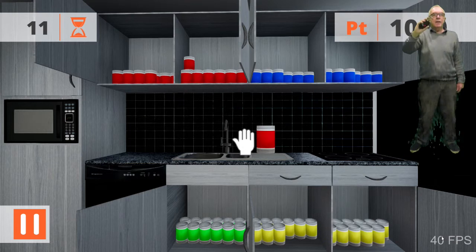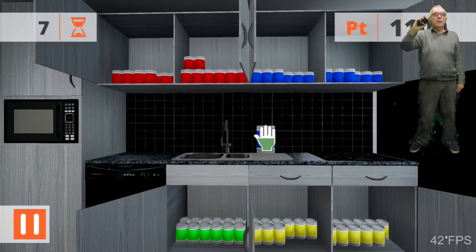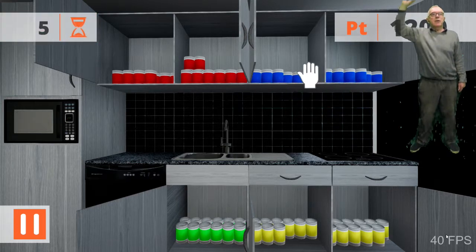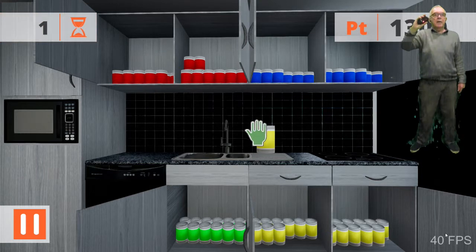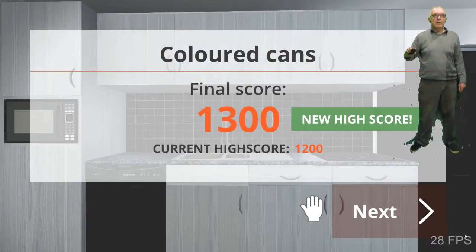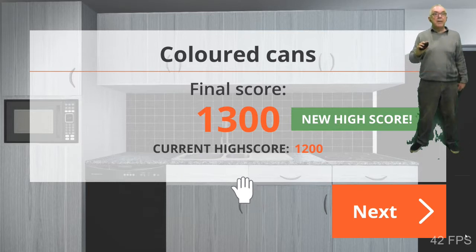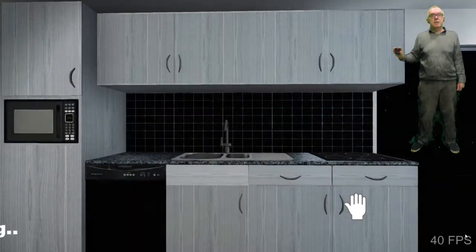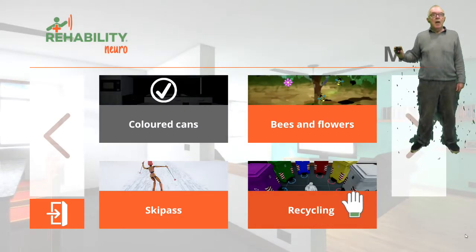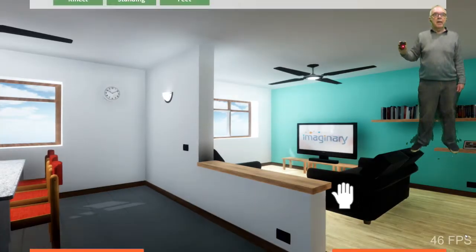So another red can, another red can, moving quickly now, just got a few seconds left, blue can, red can, and yellow can. I've got a new high score, so I did better than my last exercise. So now I'm going to move on to the next exercise. And I think I'm going to choose the recycling bin.